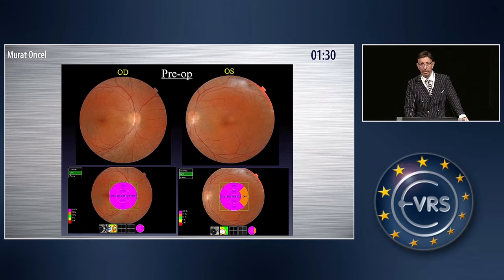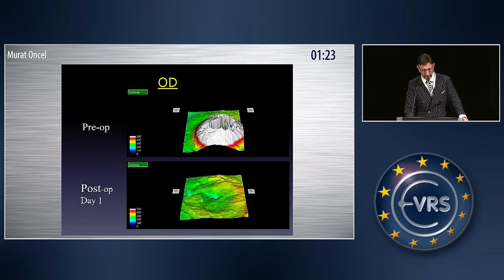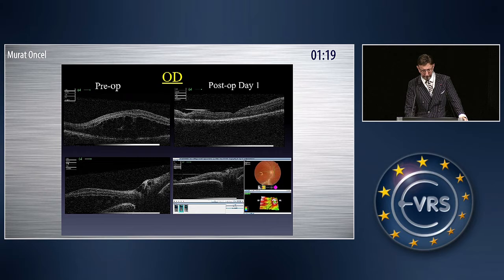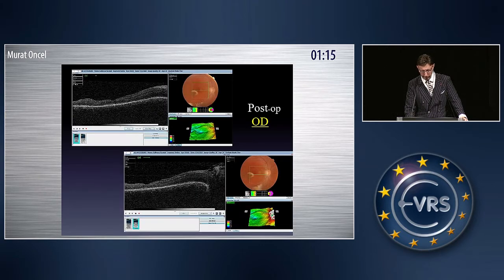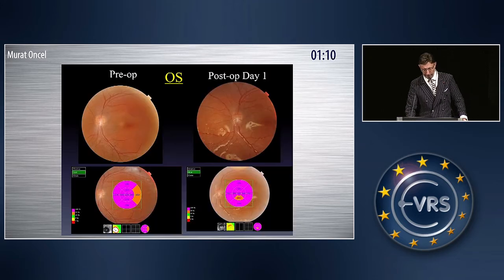This is a patient with bilateral optic disc pits with macular detachment. Here you see the pre-op and post-op day one with heavy silicone oil. At post-op day one, the macular detachment is totally flat. There is no subretinal fluid in the OCT as you see here — this is the right eye. And here you see the inverted ILM flap covering the optic disc pit, closing the optic pit.